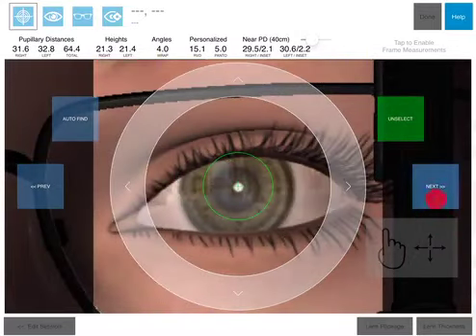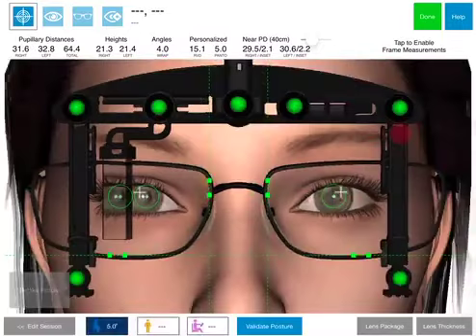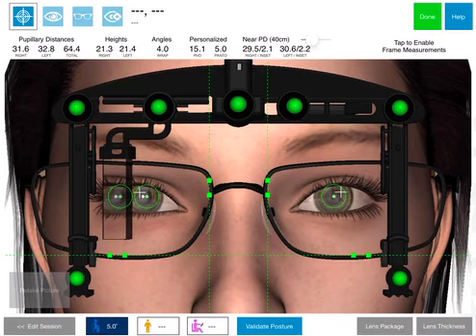Note that two reflections are formed on the right pupil and inside the prism. The nasal most reflection should be used in each case. A white fitting cross indicates where the customer is looking through the lens by taking the pupil marker location and compensating for eye convergence and parallax. The white fitting cross is drawn automatically by the app and is not set manually.